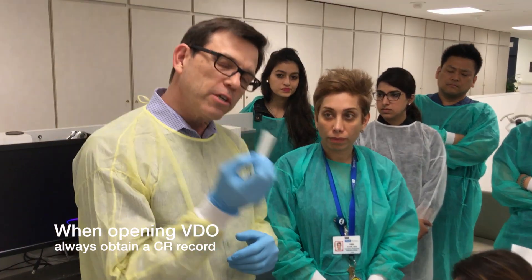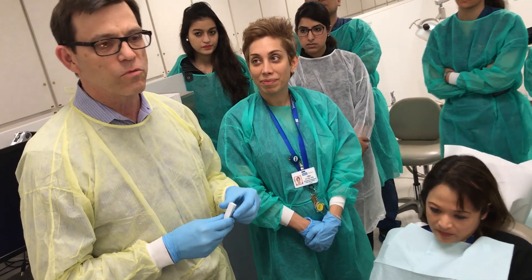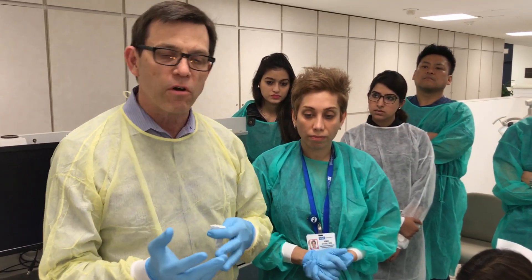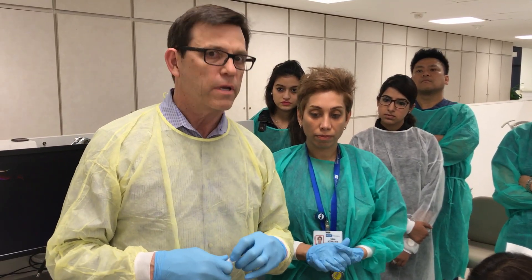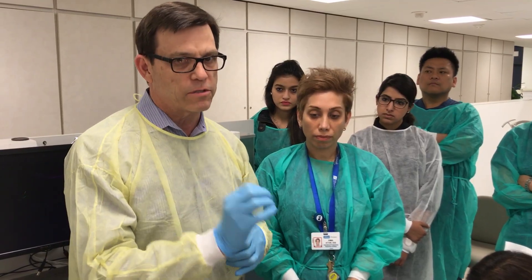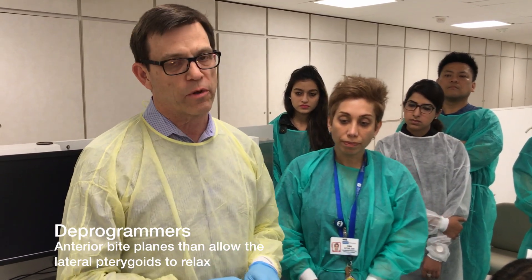A leaf gauge is only good to deprogram patients that are deprogrammable. Sometimes patients are not readily deprogrammable. They're in a situation where they're experiencing some joint pain, they have muscle pain, they may be parafunctioning and they don't feel like they have any one bite. They'll tend to fight you and your CR record will be unsuccessful. So you have to realize that there is a group of patients that will benefit from deprogramming prior to centric relation records. Allow them to be deprogrammed, which may take up to one month, and then take your centric relation record.